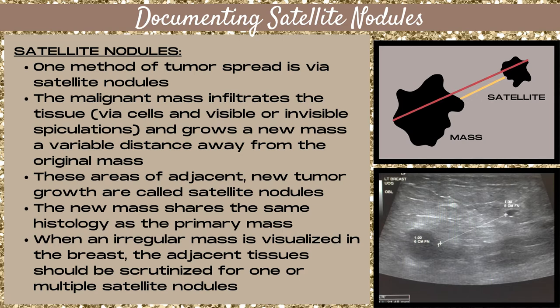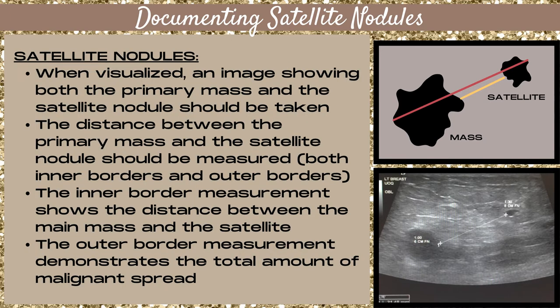The new mass shares the same histology as the primary mass. When an irregular mass is visualized in the breast, the adjacent tissues — at the very least that quadrant — around the mass should be carefully scrutinized to see if there are one or more satellite nodules present. When you visualize a satellite mass, you need to take an image showing both the primary mass and the satellite nodule.